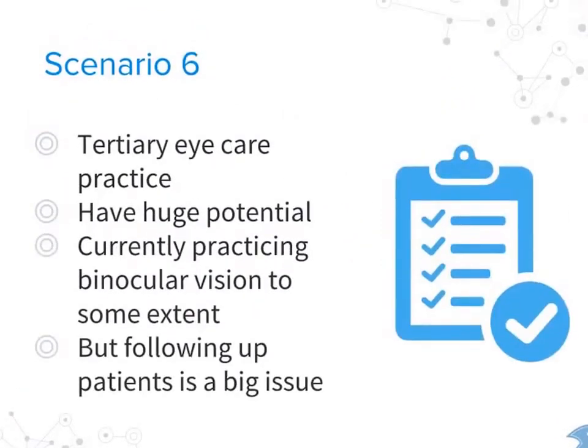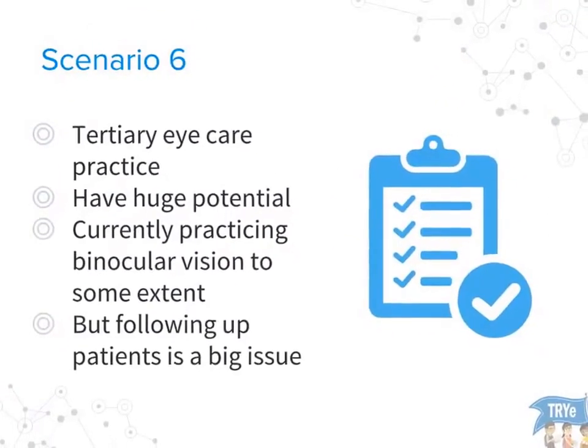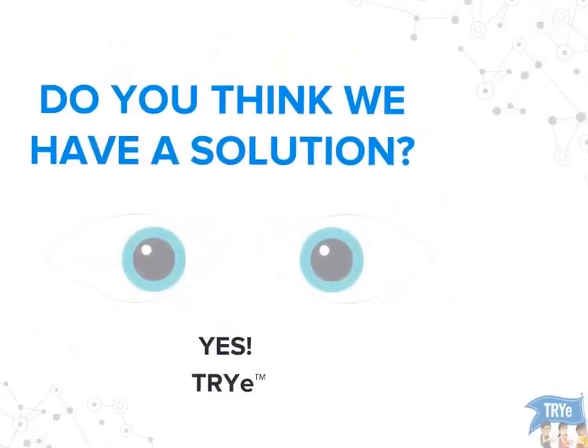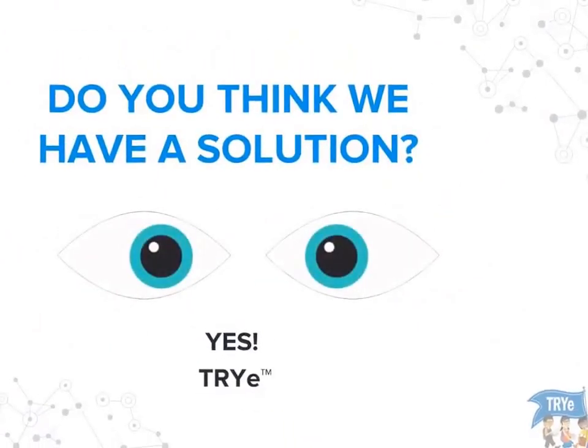Or you belong to a tertiary eye care practice where there is already a huge potential for patients. And you're also practicing binocular vision to some extent, but following up patients is a big issue. Wherever you could find yourself fitting in, do you think we have a solution?